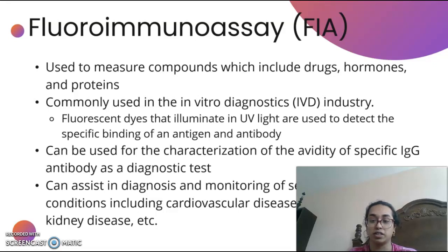Also, a modern fluorescent-based immunoassay uses the detection reagent, a fluorescent compound which absorbs light or energy, also known as excitation energy, at a specific wavelength and then emits light or energy at a different wavelength. In this assay, the antibodies are labeled with a fluorescent molecule, and so once they have bound to the target antigen, the fluorescence label can be quantified, which indicates the concentration of the antigen.